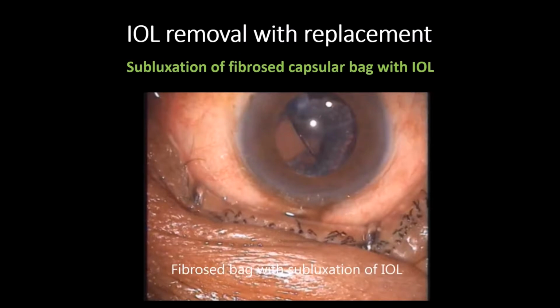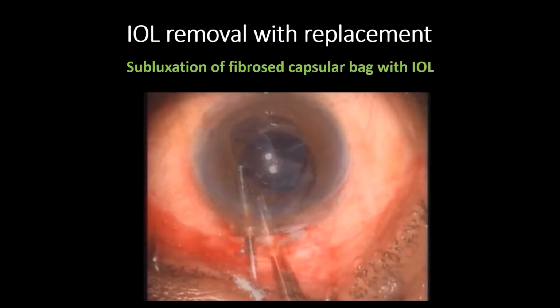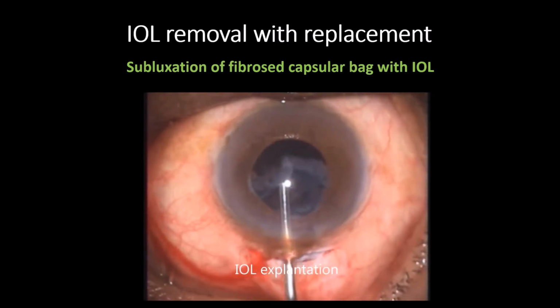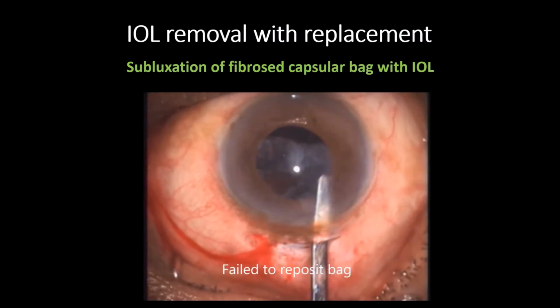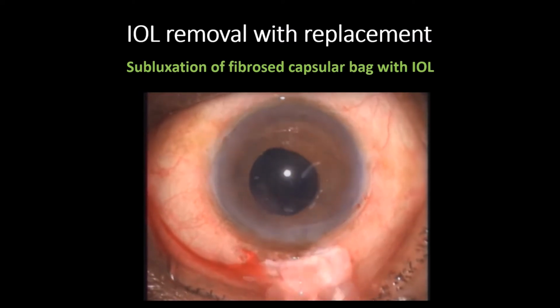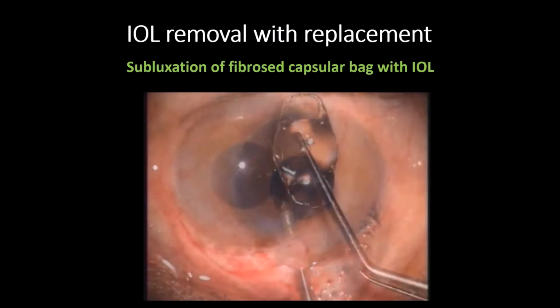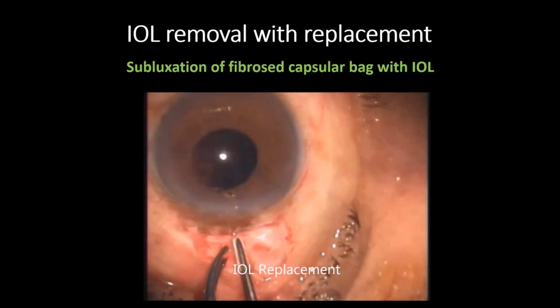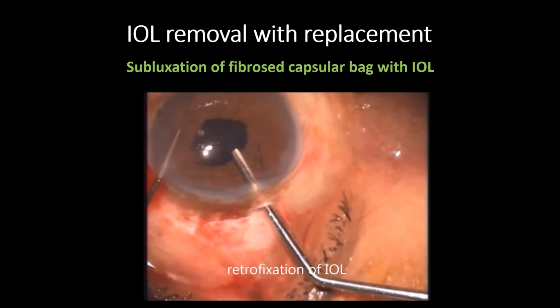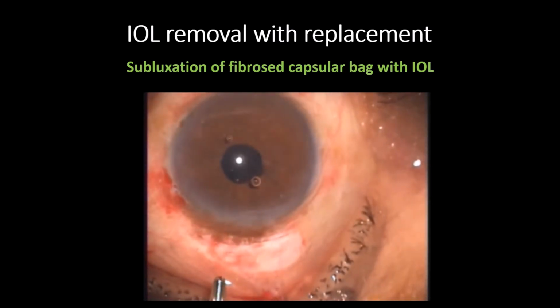This was quite an interesting case where there was a fibrosed capsule, with subluxation of the fibrosed capsule along with the IOL. While removing the IOL, this subluxated fibrosed capsule started coming out. So it was repositioned back and we tried to open the capsule but failed. So the decision was taken to remove this fibrosed capsule. See the dense synechia. After removing the capsule, anterior vitrectomy is done to create a space between the iris and the vitreous. And in this created space, a retrofixation IOL was tucked from behind, and the IOL got its home back, at least near to the home.